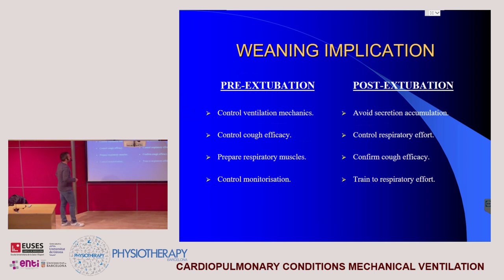Again, we have to prepare the muscles to being extubated. You remember when we told about the T-tube test, we need to realize that those muscles, respiratory muscles, will support that effort of breathing again physiologically. And just after the extubation, we have to evaluate that all our work during the pre-extubation moment has been achieved.